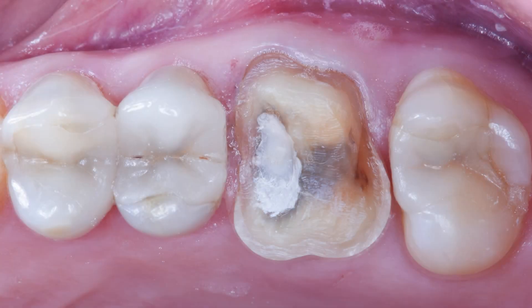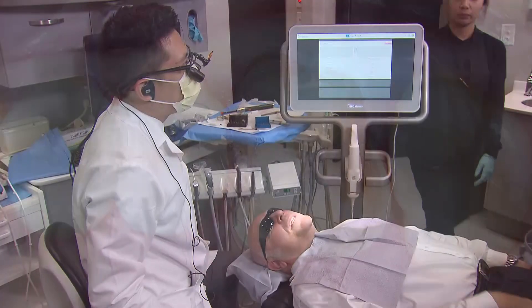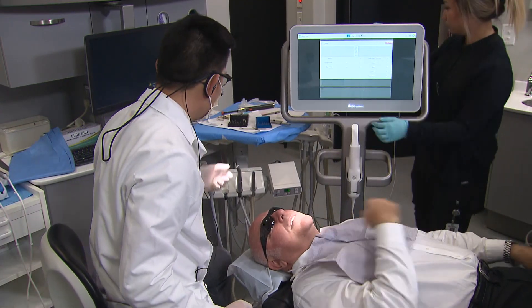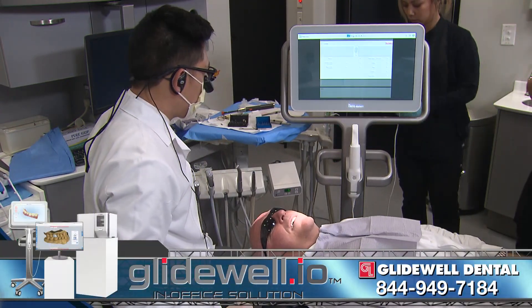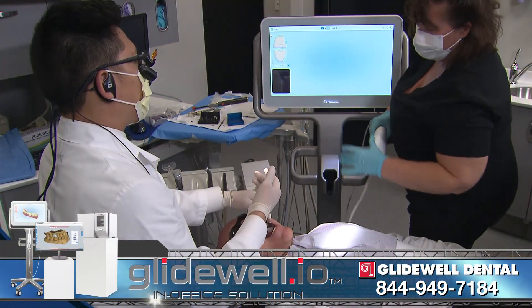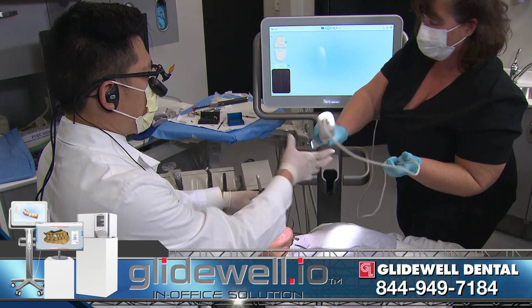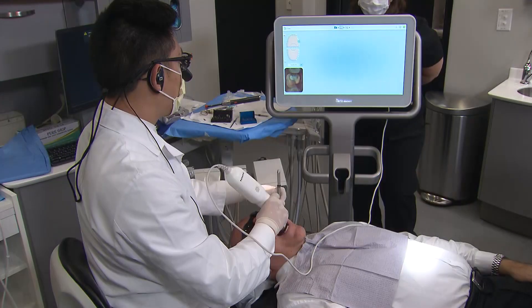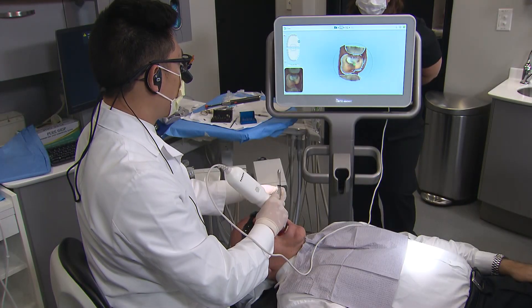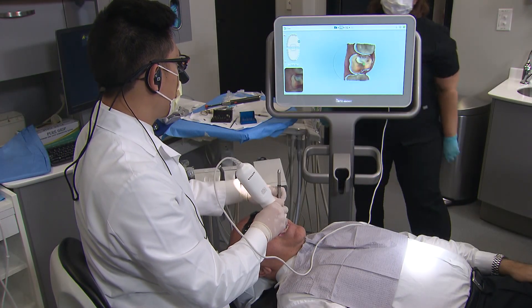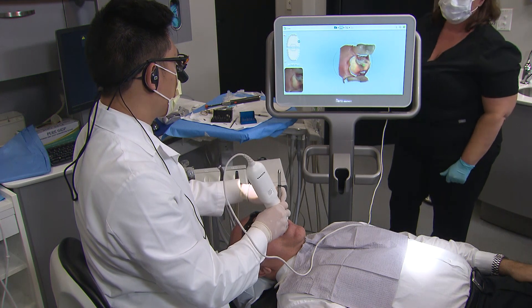Once the tooth is prepared, the impression is captured digitally with the iTero Element Scanner. There are four sets of scans we need to acquire: the prep, the rest of the prep quad, the opposing teeth, and the bite.